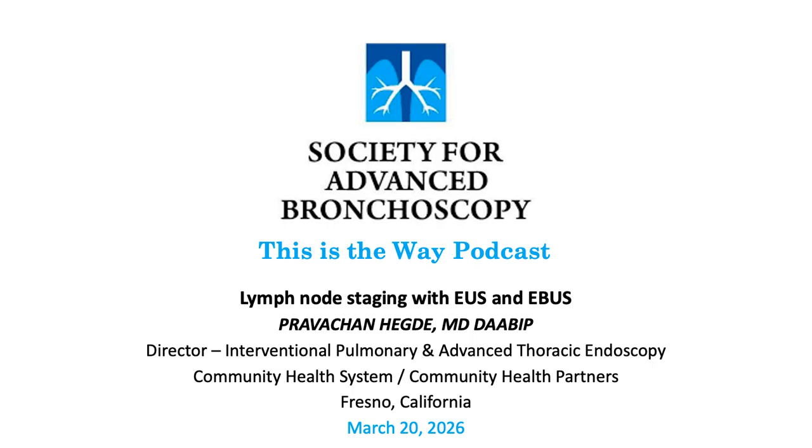Most interventional pulmonologists are very good at using the EBUS scopes and the mediastinal anatomy. So doing EUS through the EBUS scope, which is basically EUS-B. If you look at the data, there is not much difference in yield when accessing certain stations accessible by EUS with the EBUS scope or the conventional EUS scope.